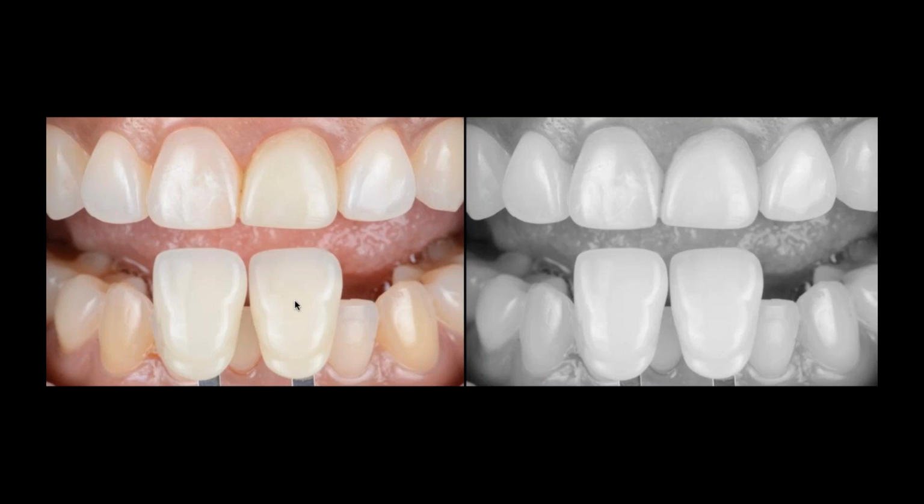Before we do that, it's very important at the beginning of the appointment to determine the proper shade of the contralateral tooth, because once we get started working, teeth will dehydrate and we won't be able to have the ideal shade selection. So this is always the first step, okay? Make sure the teeth are very hydrated, and I always help myself with good photography. I will use the 3D Master Shade Guide, or the classical if it's a very easy case.